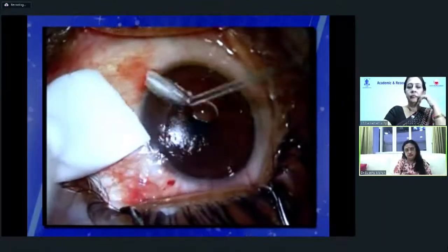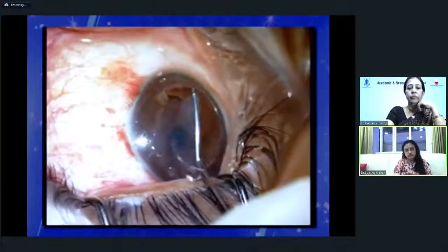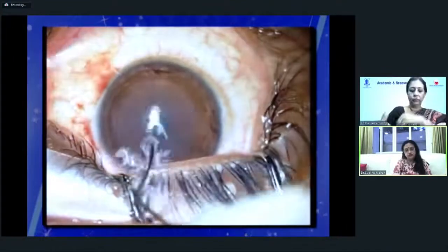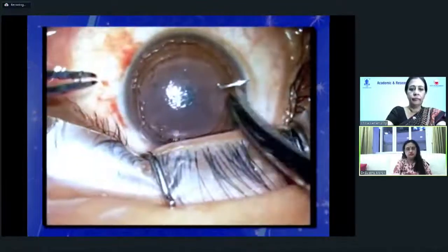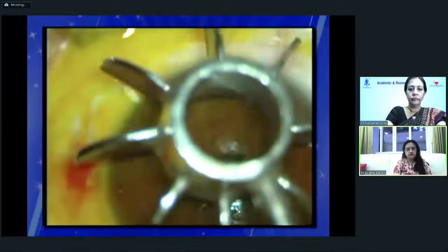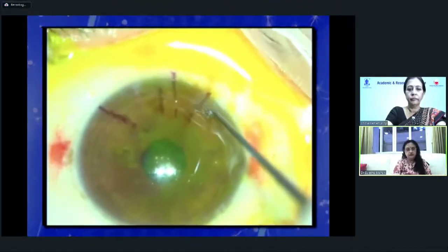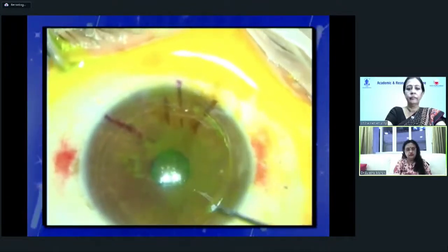The rolled up flap edges are gently scraped off the epithelial ingrowth and replaced. Suturing the flap is mandatory in this situation to prevent repeat flap slippage and epithelial ingrowth. Femto flaps show less incidence of flap displacement and striae due to better fitting of the flap on the bed. However, this femto flap shows radiating flap striae originating from the hinge.